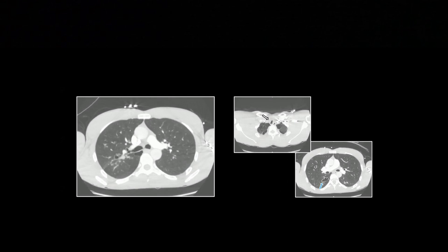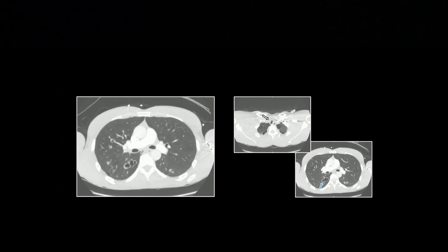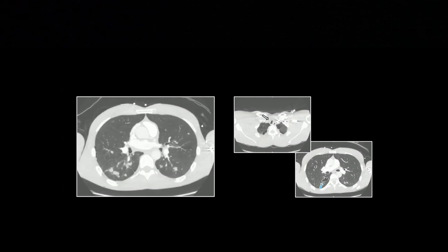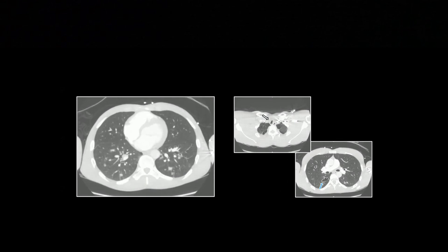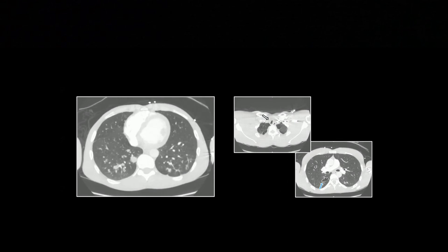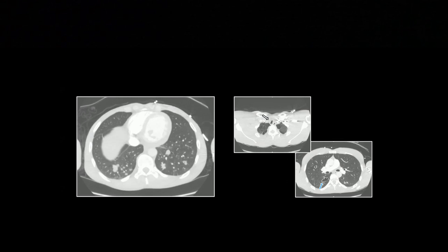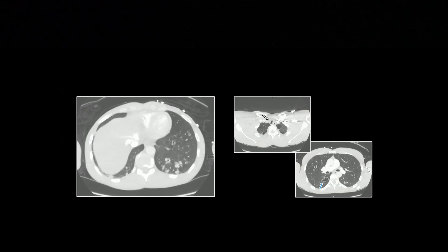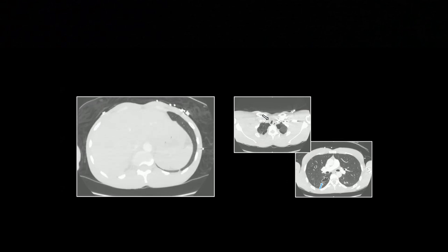Look how irregular that trachea was. And again, thin-walled cysts with a bunch of nodules that are yet to shell out completely.